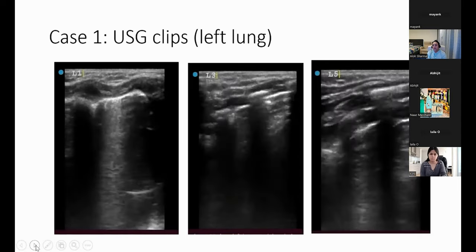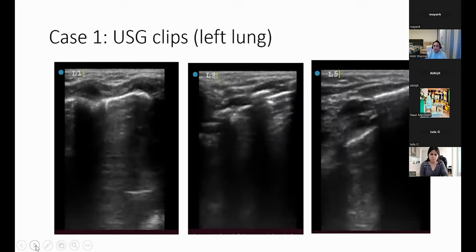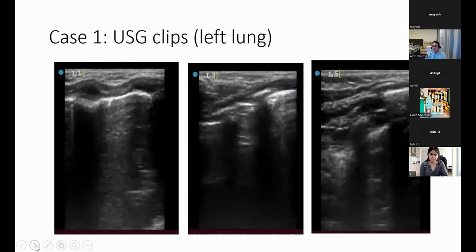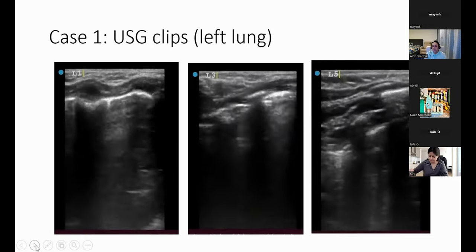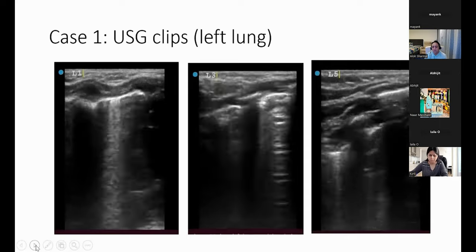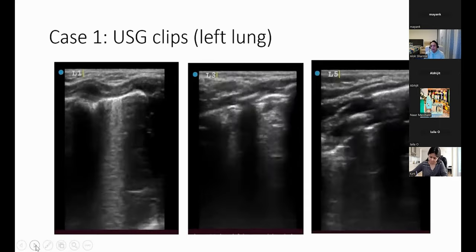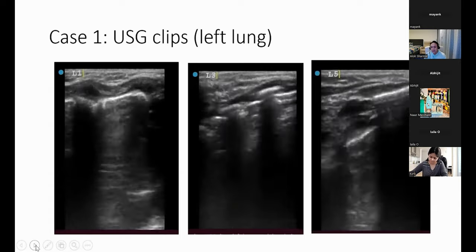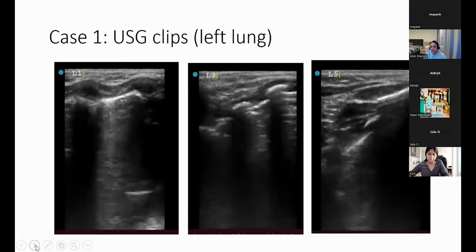For those of you who don't have a preset lung mode, MSK superficial is beautiful for lung in preterm babies and extremely preterm babies. You can use it. What it does is it resets to a default depth, usually of about 2-2.5 centimeters. So you might have to increase that to 4. And then if you want to get 3 ribs, because you've obviously increased depth, you might have to zoom in, zoom out a little bit.